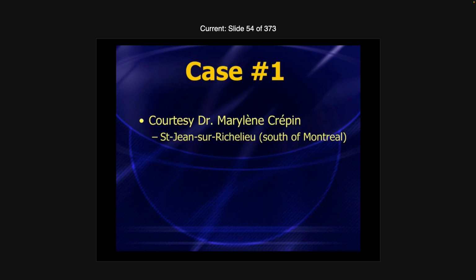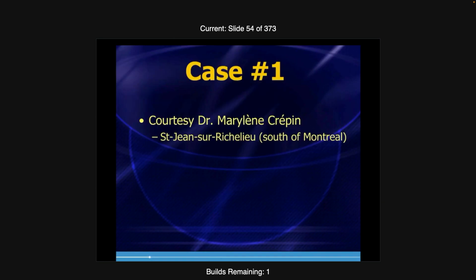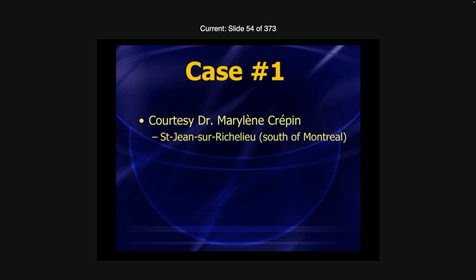But my thanks to this physician. Okay, I'm starting 3 minutes in, because the 3 minutes of introduction are not worthwhile. He's saying thanks to this doctor. His format is he usually gets sent 12-leads from other doctors, and they send the case and everything, and then he talks about it. Case 1.